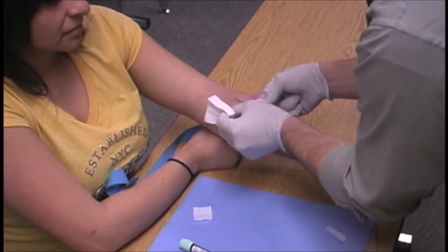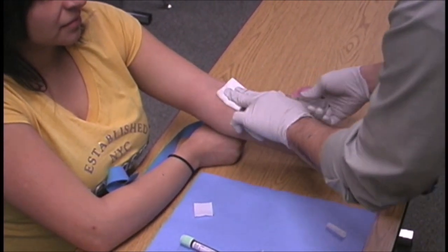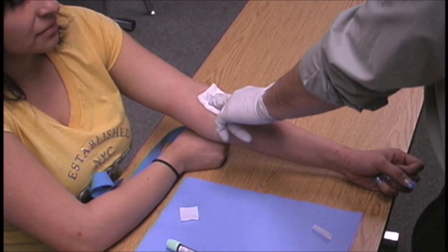He picks up his two-by-twos, gets close to the needle, and takes the needle out at the same angle. He then engages the OSHA-approved safety device over the needle.